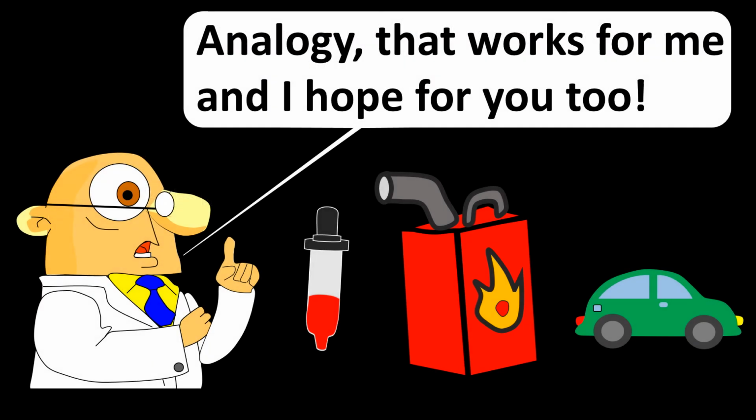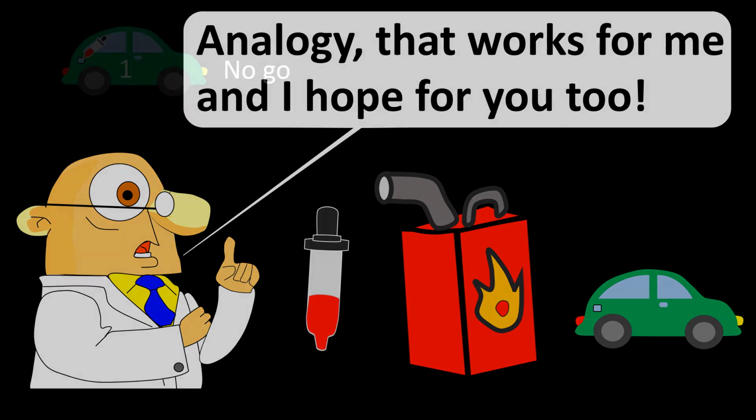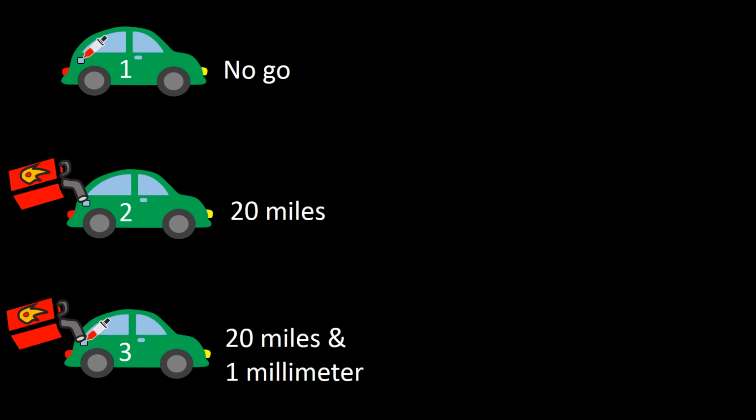I am going back to the analog that I used at the very beginning, which included a dropper half full of gas, a gallon of gas, and a car. Here, car 1 is fueled only by the gas in the half full dropper that we describe as coming from the brain at a specific time. And as you can see, such an amount of gas will not make the car go. Car 2 is fueled by a gallon of gas, which will go 20 miles. Car number 3 is fueled by the gas in the gallon and also by the gas in the dropper, and this car will advance 20 miles and 1 millimeter.